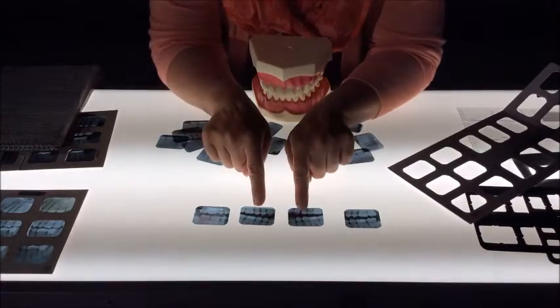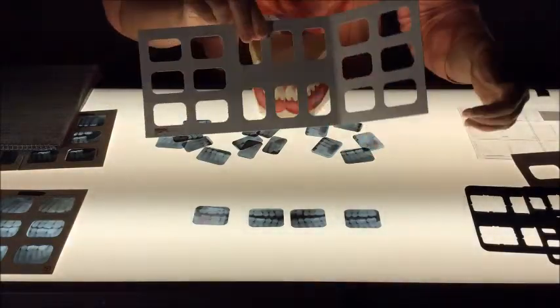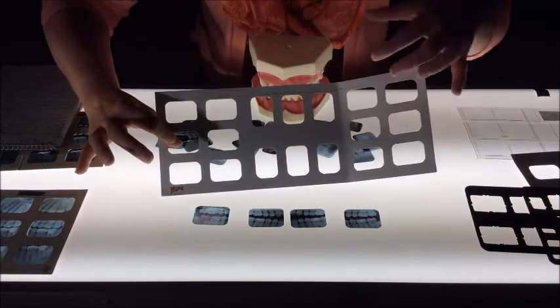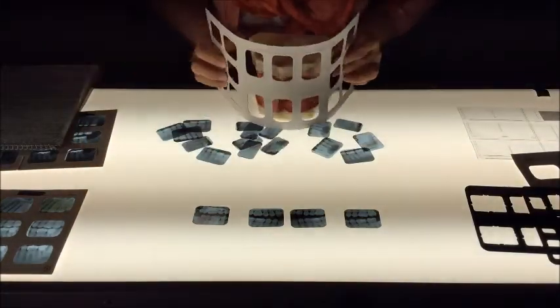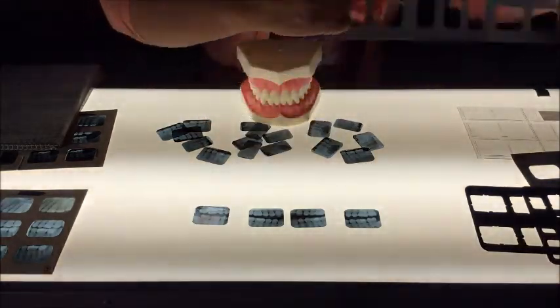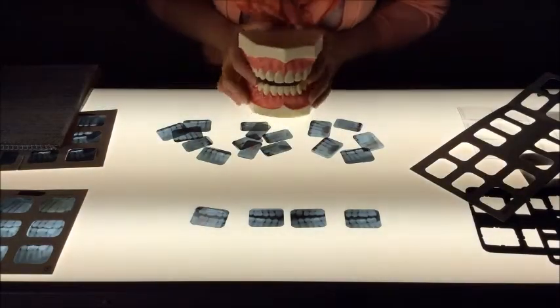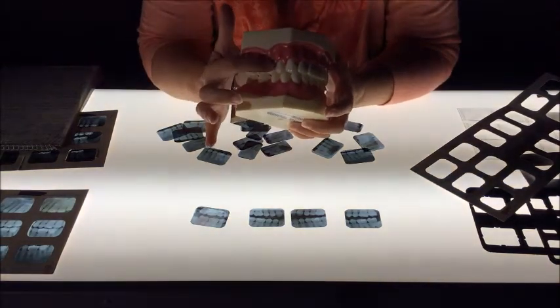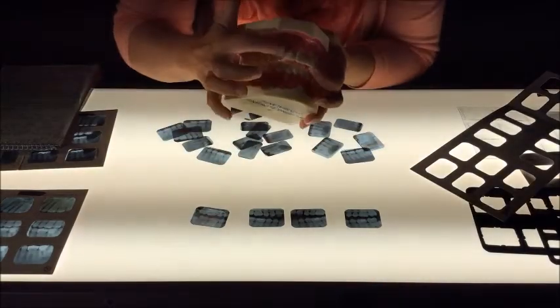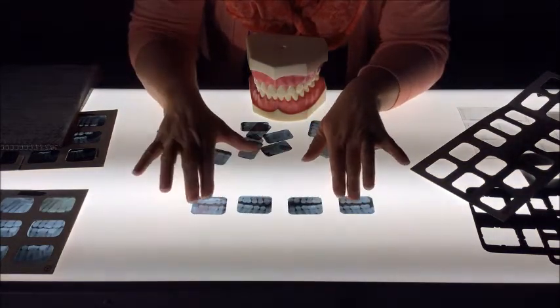Once we can find the films that show most of the premolars, we're going to put them in the center, as they would go closest to the middle, right in here, of your film mount. And again, the molars would go further in the back, similar to how it's orientated around the patient's mouth here. So again, this would be the molars because it's showing more of the bone in the back. Generally, molars can be 1, 2 to 3 molars. Premolars are generally 2 on the top, 2 on the bottom. Premolars also may show the pointed canine on the tops and the bottom. So we'd have our bite wings in line here.